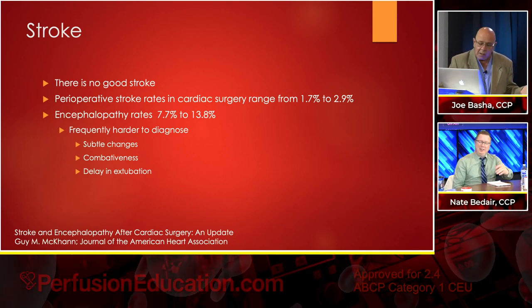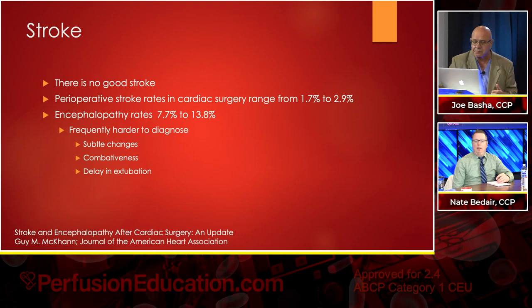Are you asking me? Yeah, I'm just asking. I would think that it'd be flow related mostly because of the manipulations we're doing with the heart. All of our surgeons come down on flow. Maybe one or two will just want you to come down to minimal flow, a liter or whatever. For what? To put the cross clamp on. Oh yeah, but that's very transient.